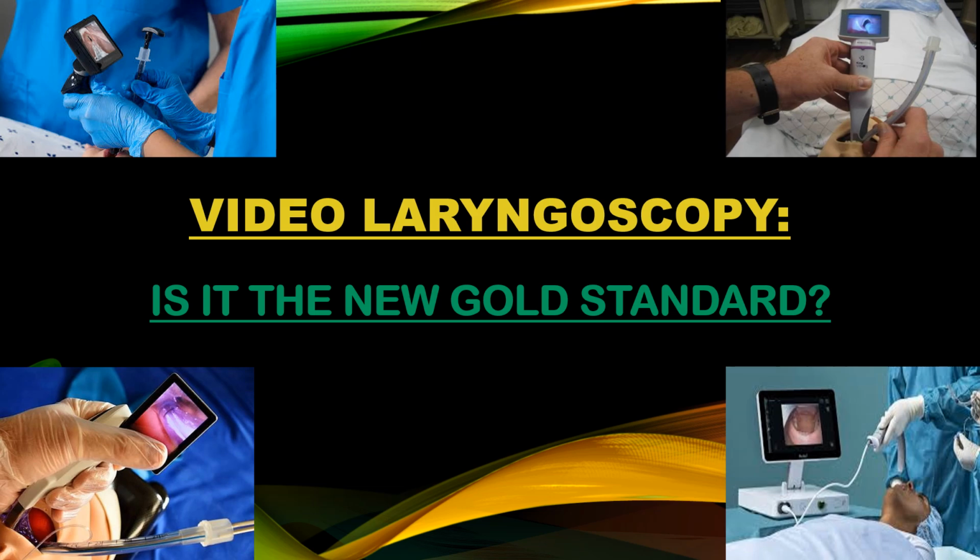Video laryngoscopy. Is it the new gold standard? See the airway clearly. Video changes everything. What was once blind is now on screen. Improve first pass success. Higher success rates. Fewer attempts. Less trauma. Teach and learn faster.